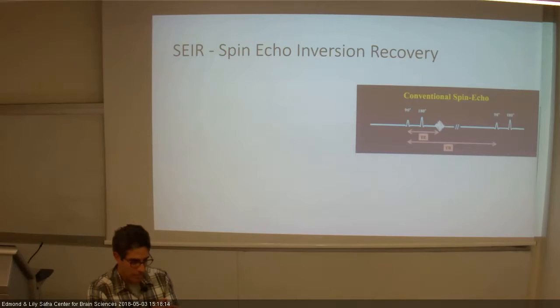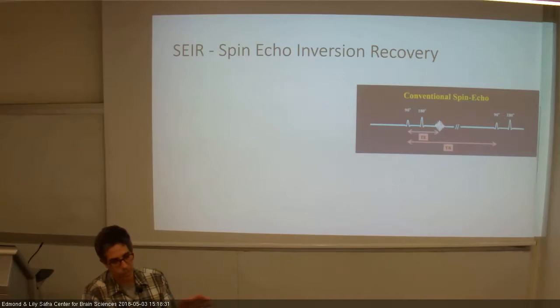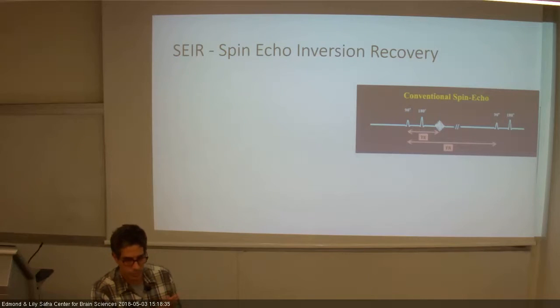And so you get an echo, and this echo is essentially you see the vector again. You see them again, like they're all in the same phase for a moment, besides the effect that came from T2, spin-to-spin interaction. This one is gone. This one is done. There's also the effect of T1, which I am ignoring right now, because it's much slower than this T2 effect.